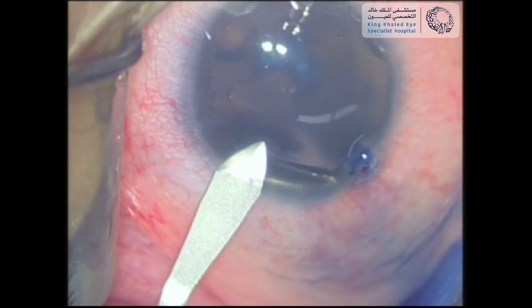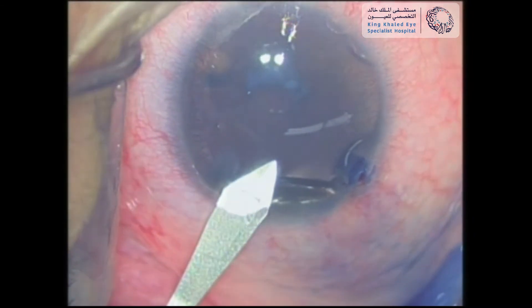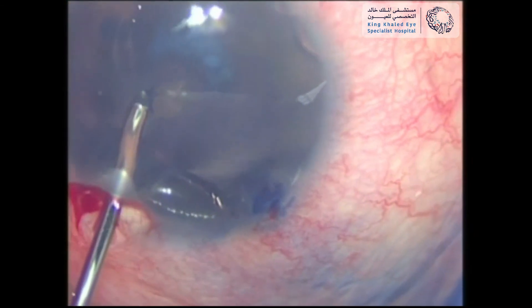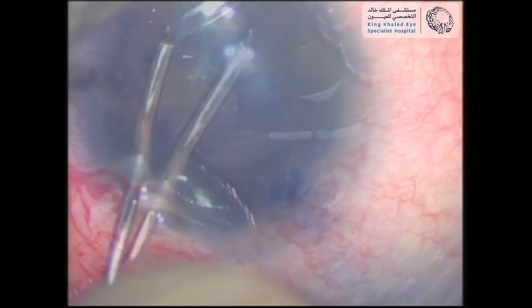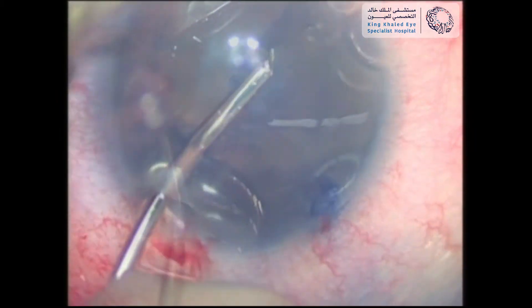Then a standard 2 mm clear corneal incision was performed approximately 90 degrees away from the side port. A 5.5 mm capsular access was done using a micro forceps in a continuous curvilinear fashion.